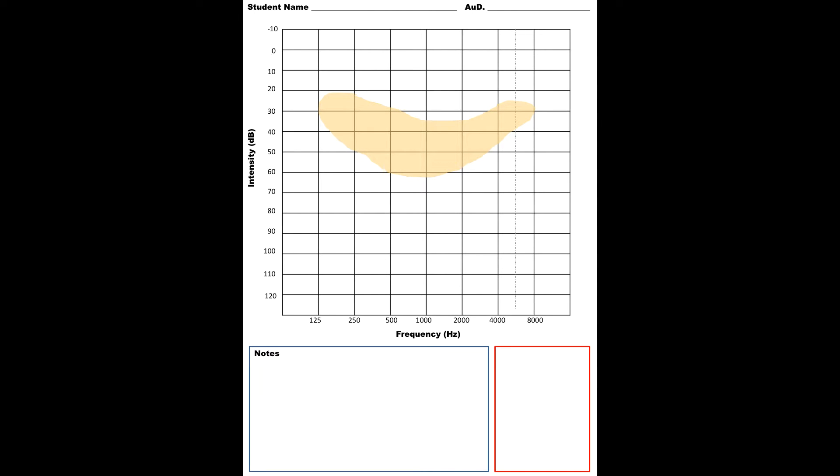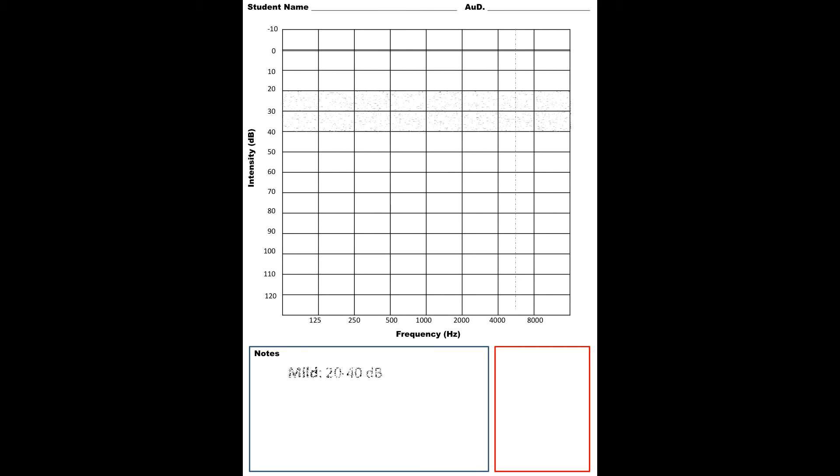This is something you're going to see a lot, and we refer to this as the speech banana. This is not exact, I kind of tried to draw it as best I could. The speech banana just includes all those speech sounds. You can see from the shaded area where speech is, those speech phonemes, where they are on the audiogram. As teachers of the deaf, if we're wanting our students to learn how to have spoken language and develop spoken language, it's really our goal to make sure that they have access to the sounds within that speech banana.